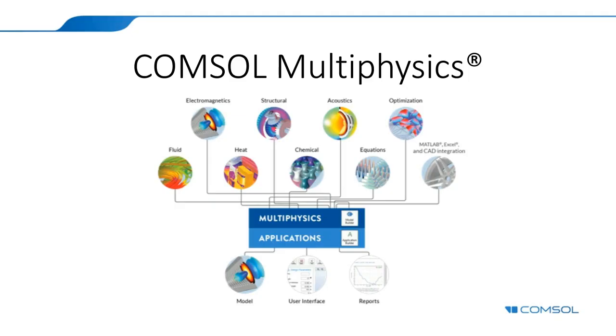But again, as soon as your model advances, you might want to start using different geometries. We can import meshes, scans, as Paul mentioned, and then you can also connect to Excel. You might have material properties there. Whatever data you have can be used in COMSOL, and then we can connect to MATLAB.